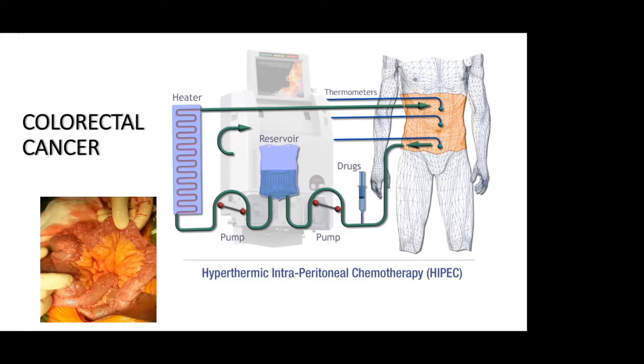Can you do this in every patient? No, of course not. The PCI is really important. The extent of peritoneal metastasis is really important, and also the location. That's where we as radiologists really come in, and where we, using different modalities, maybe add something.